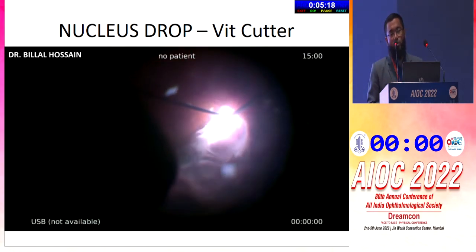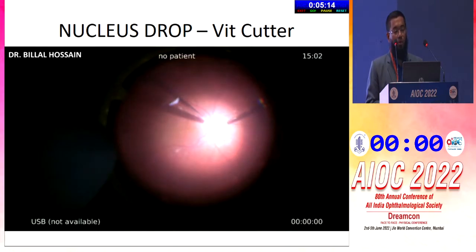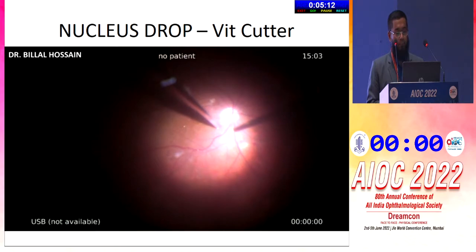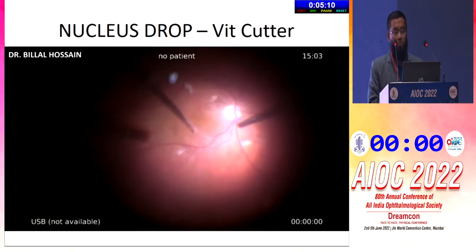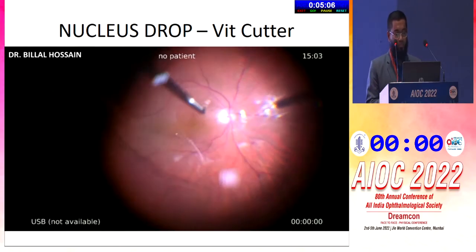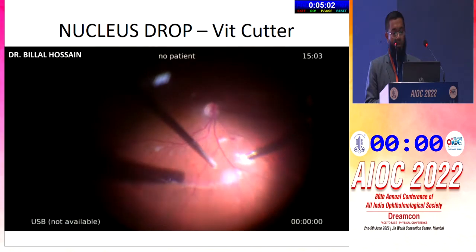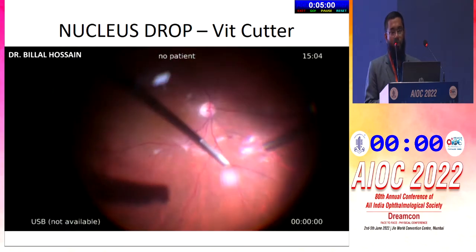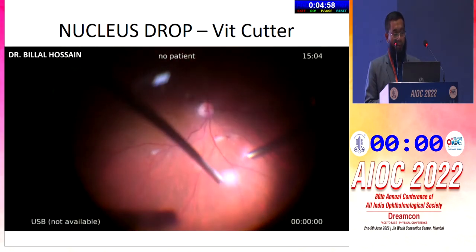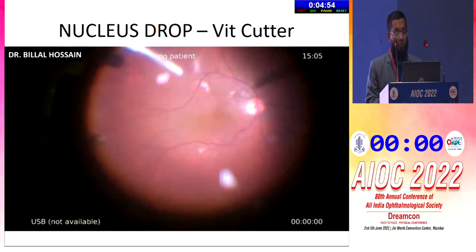In case of any vitreoretinal surgery, it is important to induce a posterior vitreous detachment for long-term safety. So for PVD, we used the TA. With the support of the TA, PVD was induced, and the IOL was implanted later on.